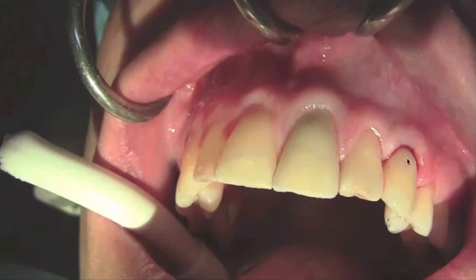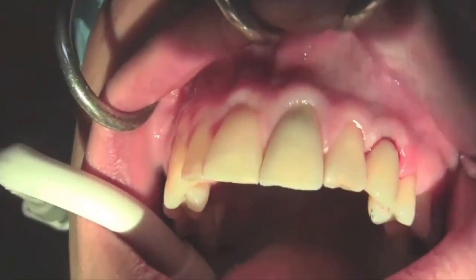This is the tooth, and you can see the excellent cosmetics that were achieved, because we didn't have to achieve any cosmetics. All we had to do was maintain the actual cosmetic appearance of the patient, maintain the position of the margin, maintain the actual interpapillary height. So it's a very interesting result.